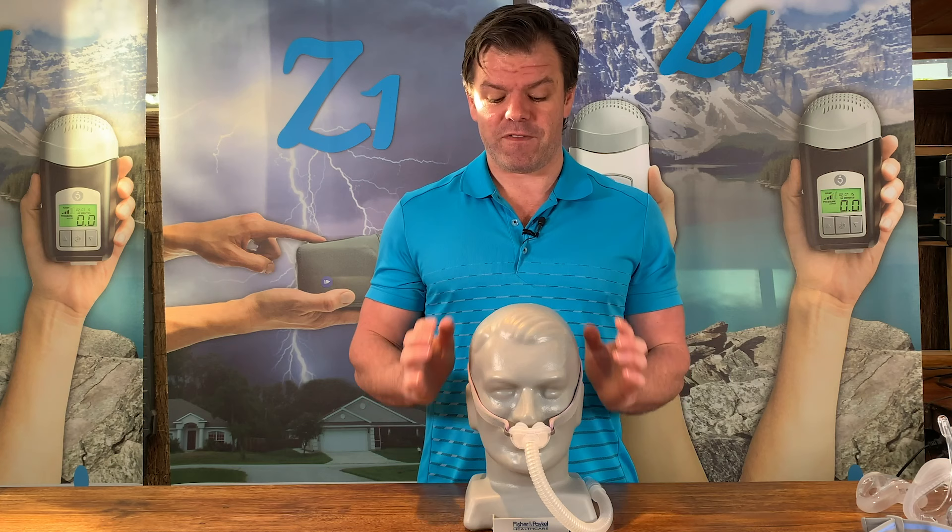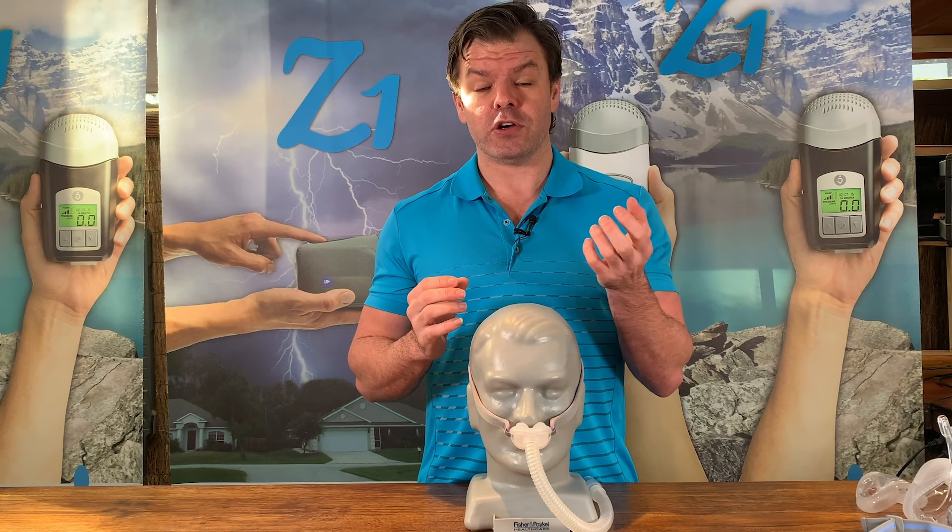Another reason I love the nasal pillow mask is that you don't get a lot of red marks on your face in the morning. With full face or nasal masks, after eight hours you tend to get red marks over the bridge of your nose and down the side of your cheeks. With the nasal pillow mask, because it seals at the nostrils, you don't get so many of those red marks. These masks also come with different size cushions so you can find one that suits your nostrils, and they generally seal really well - you don't get a whole lot of mask leaks.